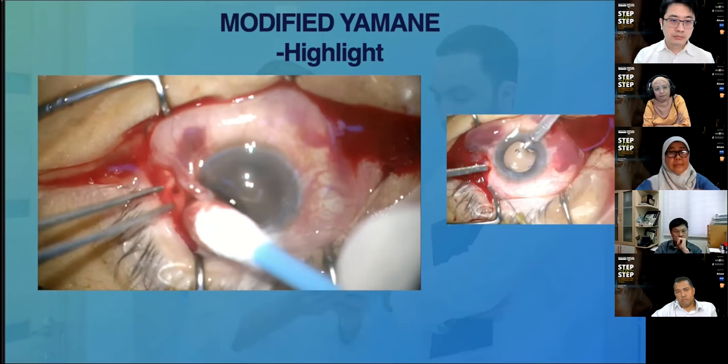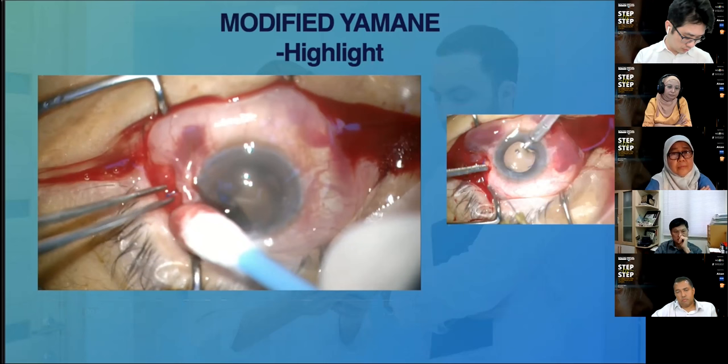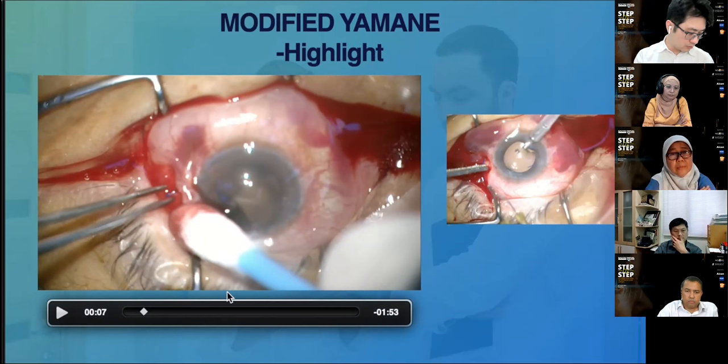As you can see, the patient was not cooperative according to the surgeon during the first surgery. So when we see the case, apparently the IOL was anchored nicely on one end, and the other haptic was actually dangling in the vitreous cavity. So in order to correct this, we need to gain access of the dangling haptic, bring it back to the anterior chamber.